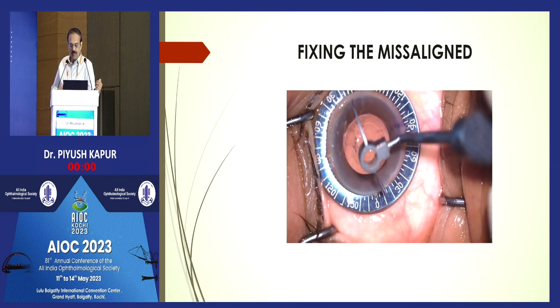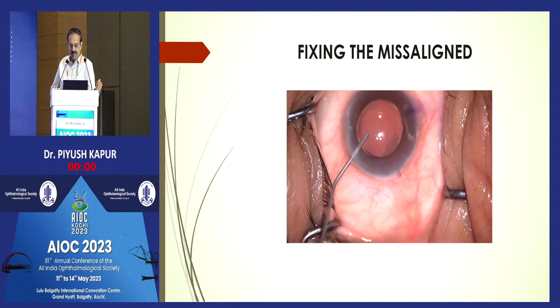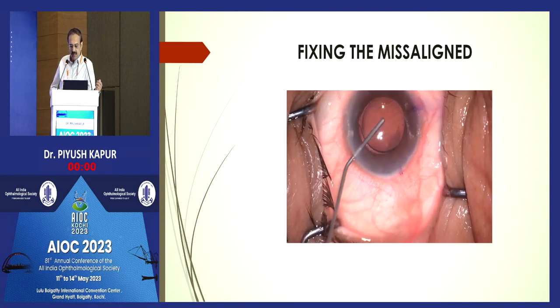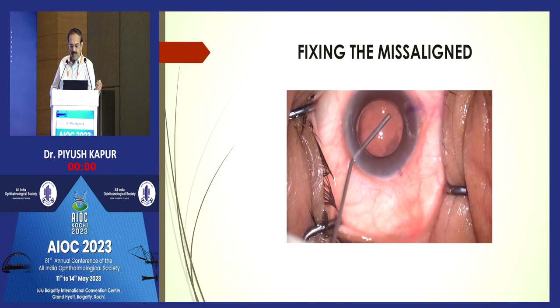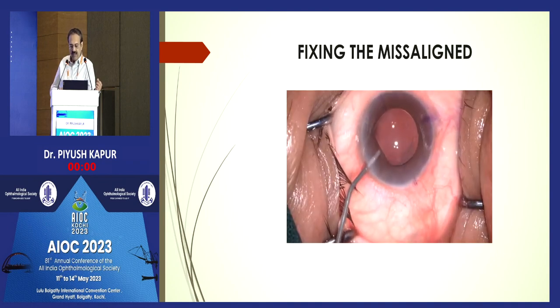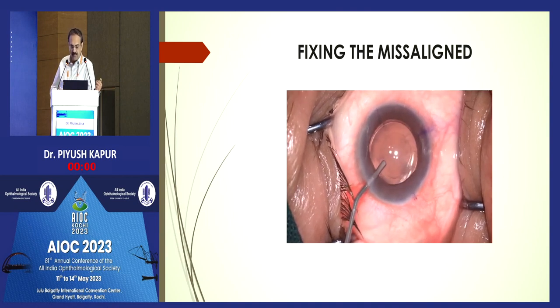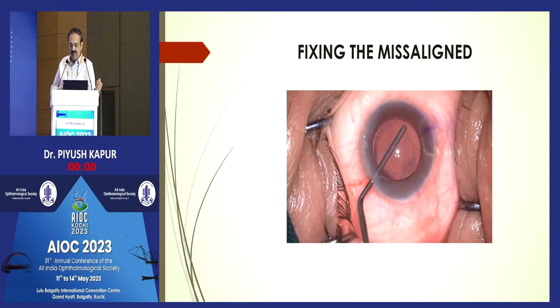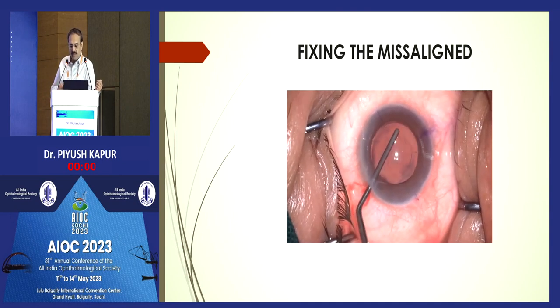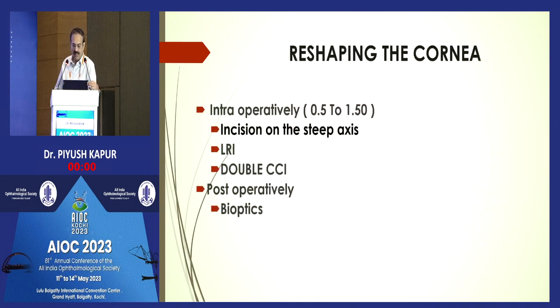This was 2 weeks post-operatively, but we went and realigned the lens by lifting the rhexis margin a little, because the capsule gets adhered to the margin of the lens, and injecting a little viscoelastic in the bag to separate the lens from the capsular margins. It's very important to be patient in these realignments, because if you are a little too aggressive, you can land up in tears.